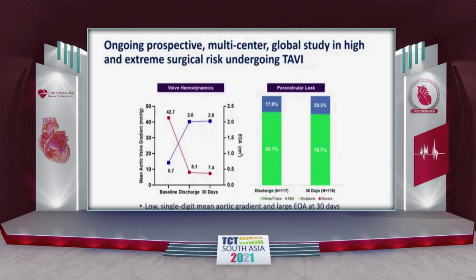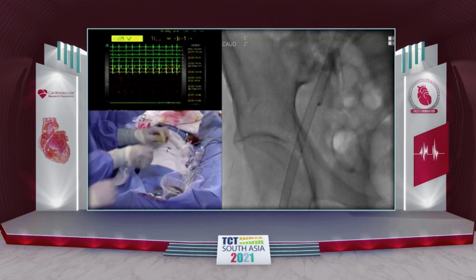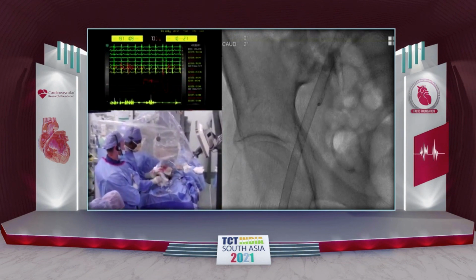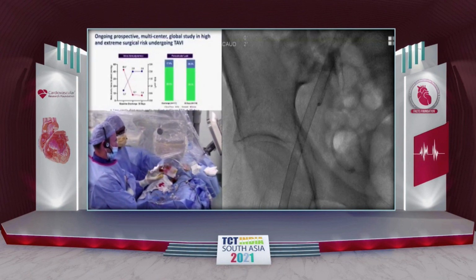So I think the benefit of supraannular is that in very small anatomies, you potentially will have lesser risk of gradient. That head-to-head study has not been done. But so far, the advantage of this technology is that despite fairly hostile landing zones, we got results that are quite acceptable. In fact, I would say excellent result. No leak, no gradient, and no conduction disturbances with a significant calcification of the LVOT. That's a surgical outcome. We've got results similar to a surgical outcome in a patient who is elderly with high risk features. So I think those are the key benefits of truly supraannular versus an annular functioning valve.